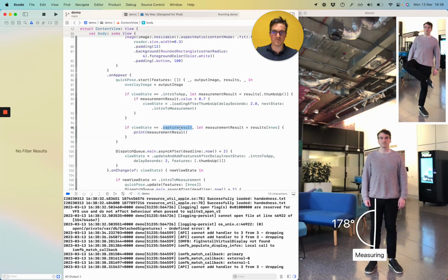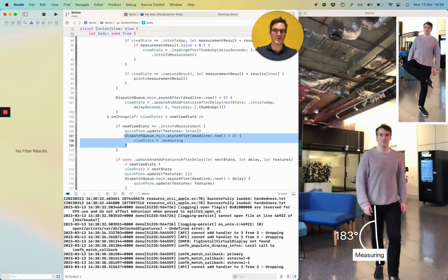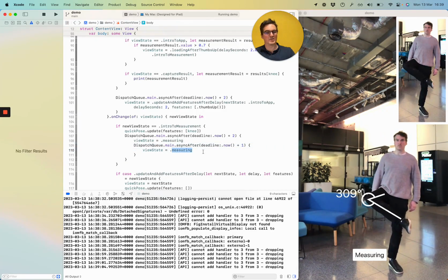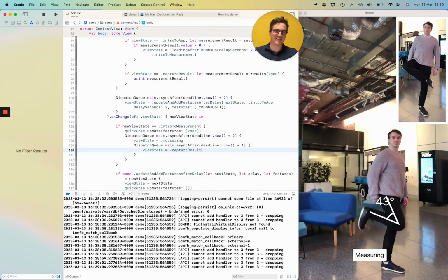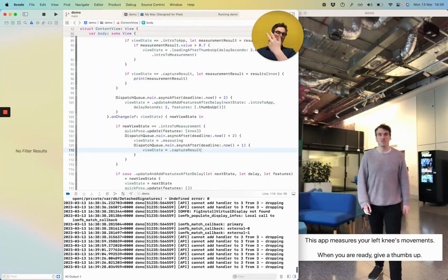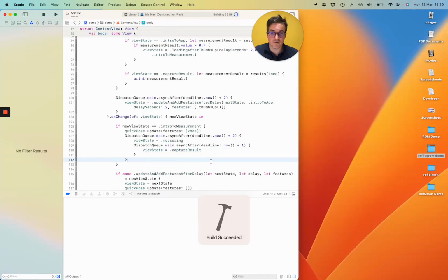Okay, so we're not transitioning into measuring. We're not transitioning to capture result yet. I don't actually see where we're doing that. So we would probably do it here. We'd allow the measuring prompt to happen. In slightly different interfaces, we could allow this to be determined by the user. So here we're building up our delays again, but that's still not really in tune with the user's experience. So they could appreciate, say, the maximum result. So your leg lifts, and then your result is measured, and the highest one, say, over a couple of seconds is captured. Or if you hold it for a few seconds, then that is stored. For now, let's just see how this works.